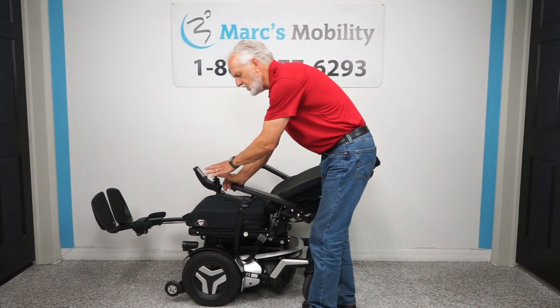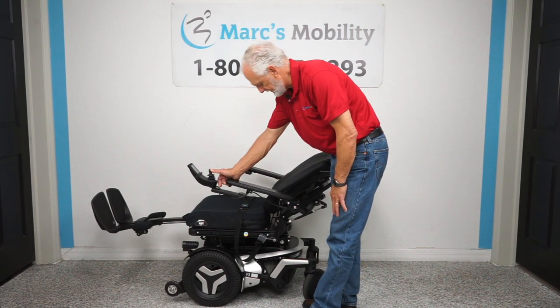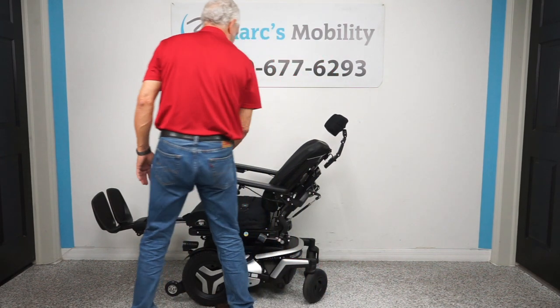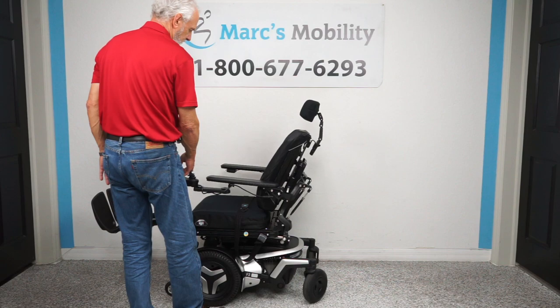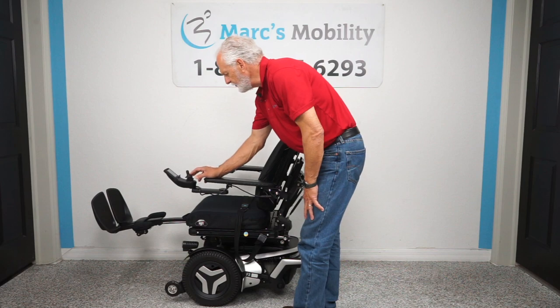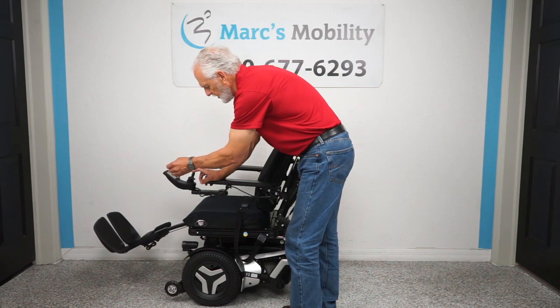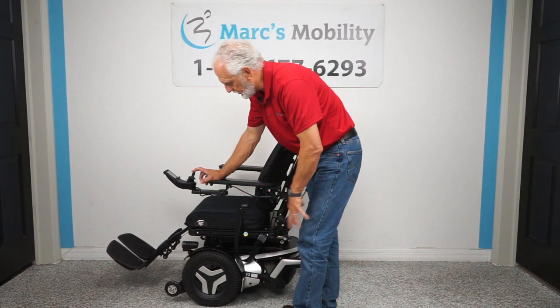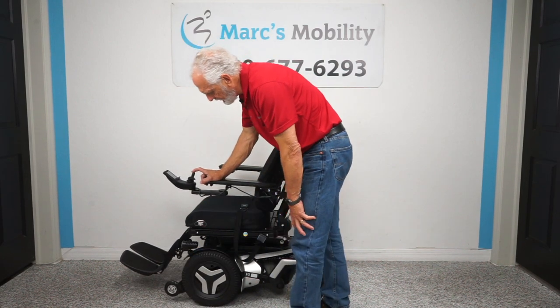The joystick is on the left side, but if you're right-handed we can put the joystick on the right side with no problem at all. Now bringing it back to a driving position and lowering the legs. The reason I'm always going backward is that different companies have different setups — on this chair everything's backwards. When you're outside, leave the legs out a little bit so you have more room for clearance.